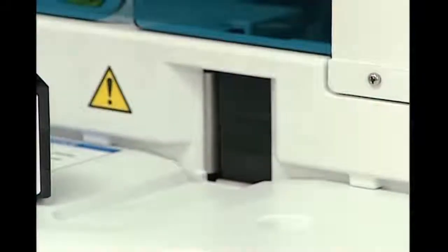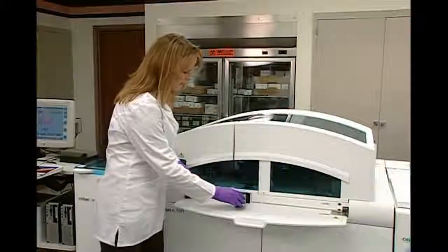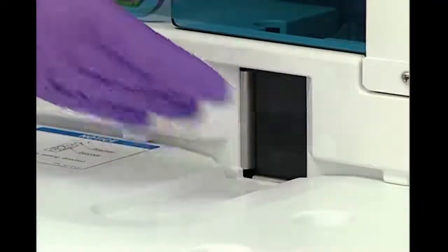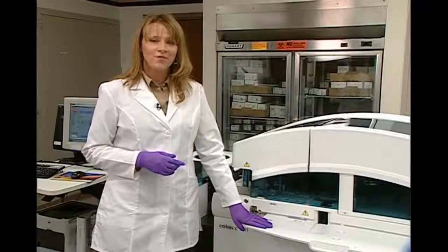Once in the system, the gripper is going to take the cassette in, pierce the caps, and then load it onto the reagent platform. Once the first reagent pack is in, I can take my second cassette and place it into the entry port. Now that we've loaded the reagents on the C501, we're now going to go and load the reagents for the E601.